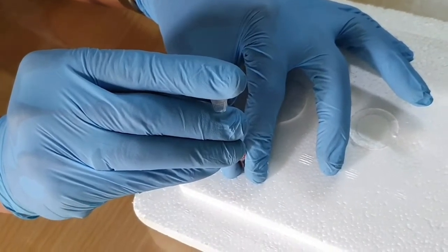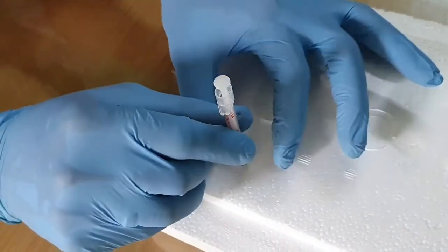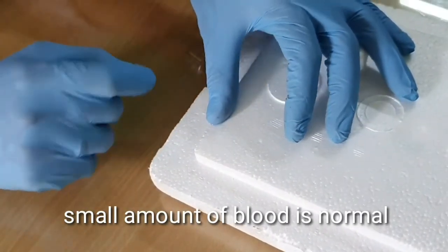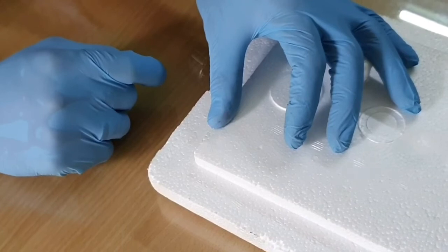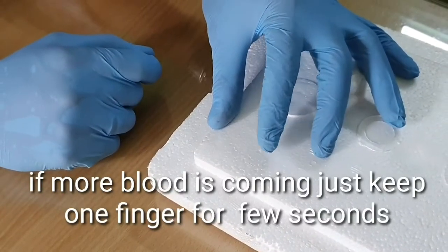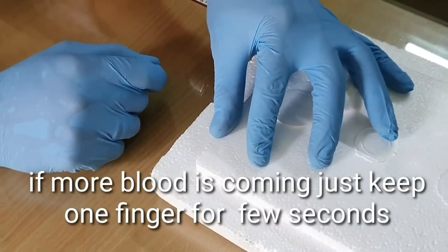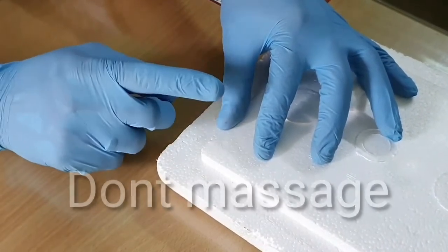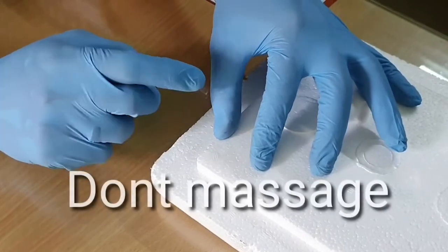Remove also straight. There can be a small amount of bleeding. If at all there is bleeding, what you need to do is just keep your finger there for about a few seconds. That will make the bleeding stop. And always remember, you are not supposed to massage, not supposed to massage.